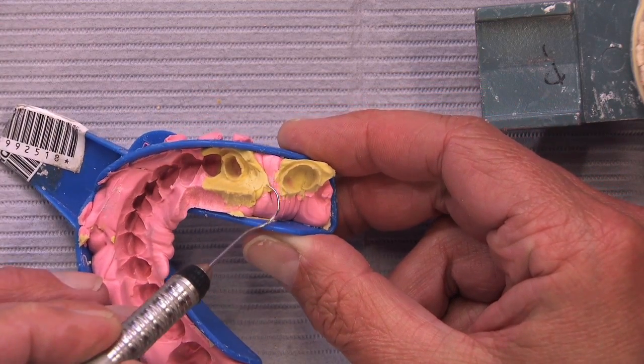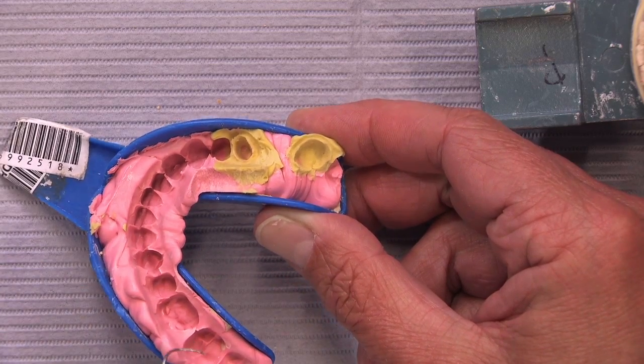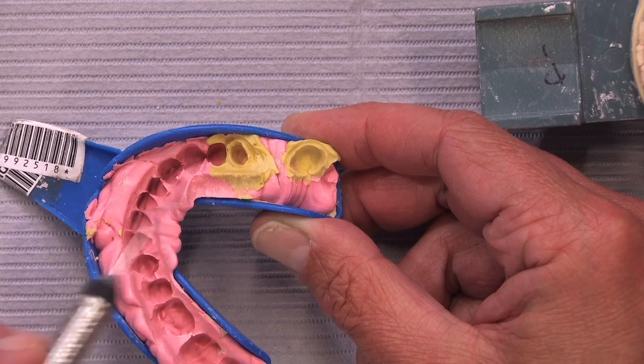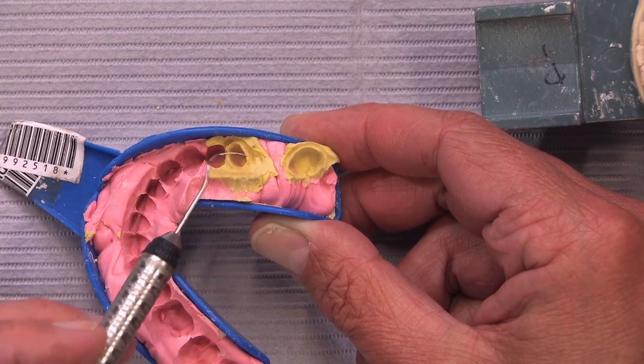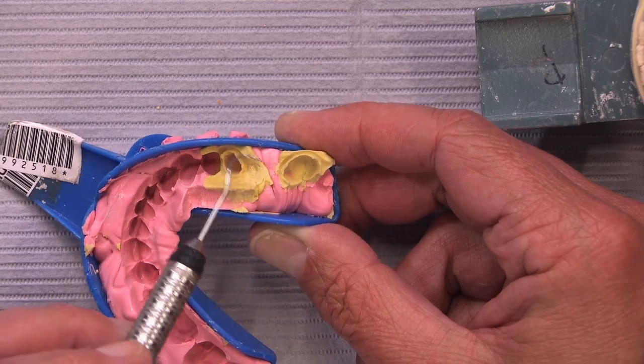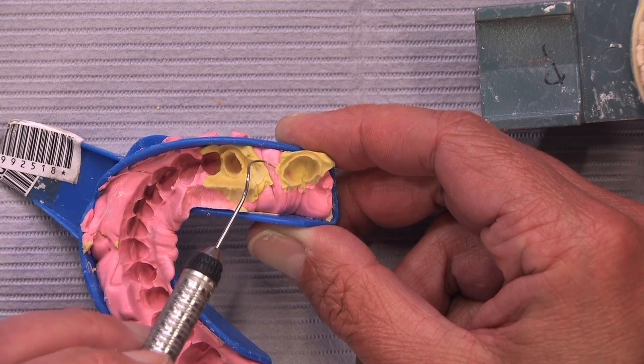But really the thing that caught my eye was the fact that there's nothing in between here. So you can tell the pink material was taken first as an impression, and then after the preps, a little wash material was squirted on the two preps. But it was such little wash material that we really don't even pick up the ridge in between here. And that's kind of the bigger issue.